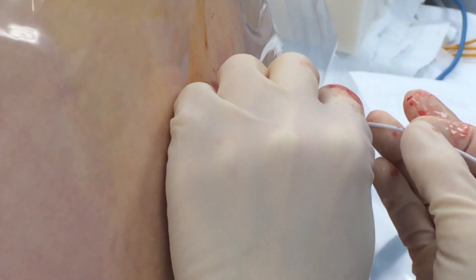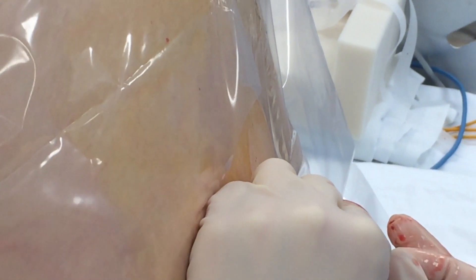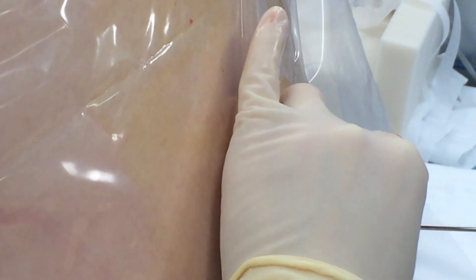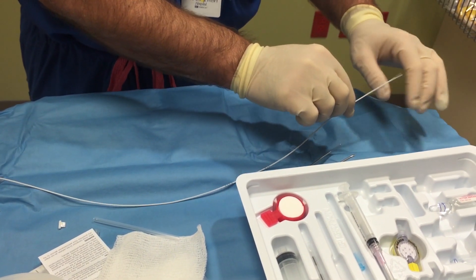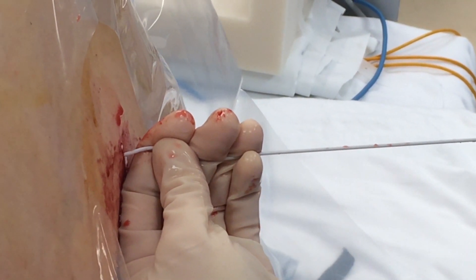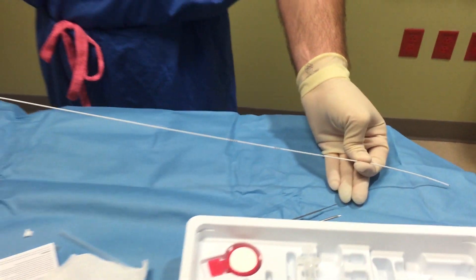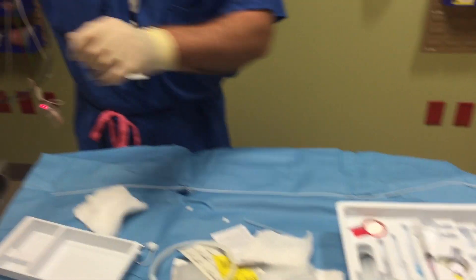When the catheter is sufficiently far-threaded, you remove the needle from the patient using the same push-pull motion you'd use for an epidural, leaving the styletted catheter in place. With the styletted catheter in place, the next requirement is to remove the stylet. Because this catheter is so thin and rubbery, you run the risk of collapsing the catheter as you remove the stylet. This is best prevented by pinching the catheter fairly firmly right as it emerges from the patient's back, and then with the catheter straight, using your other hand to remove the stylet. You'll be able to feel when the tip of the stylet is out of the patient, and then the danger's past — simply remove the stylet the entire way.